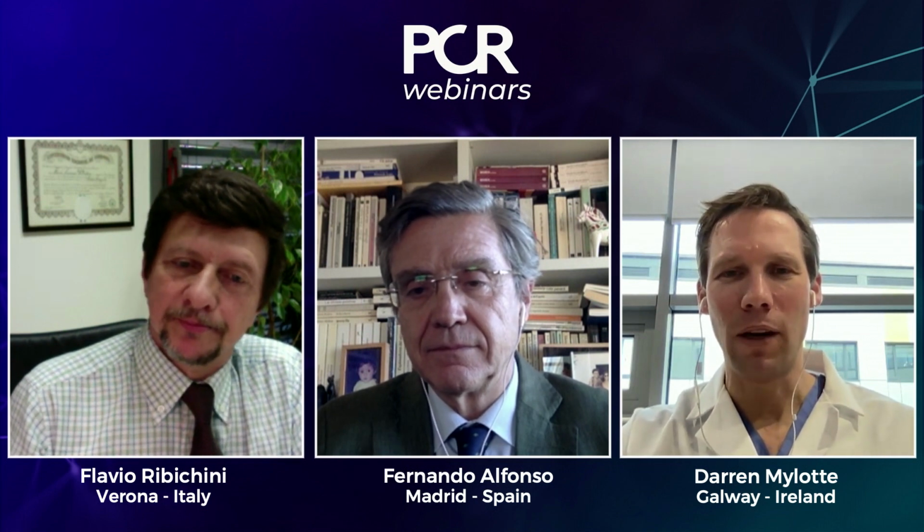Yeah, so I think that's a great question, Flavio, and I think that one of the issues we need to deal with is physician preparation for the use of DCBs. By that I mean it's very difficult to get a good result compared with a modern contemporary drug-eluting stent, where you do a quick pre-dilatation, you put the stent in, post-dilatation, and your result is pretty much guaranteed. And so this was my contention when these data started to come out.